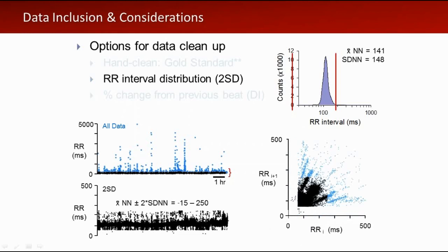And what you're hopefully able to appreciate is that you're no longer just getting that clean data here in the center, but you're actually getting all of this data to the sort of corners, which again, we know is not normal to normal. So already it's violating the criterion, the only criterion that we're using for heart rate variability inclusion analysis. So we thought maybe there has to be a better way. We want to get more accurate. We want to be able to make appropriate interpretations of our data.